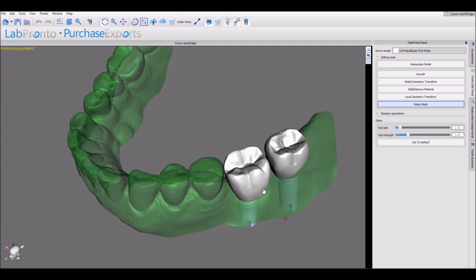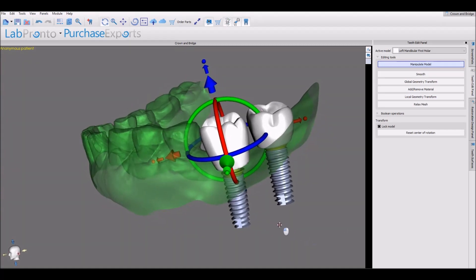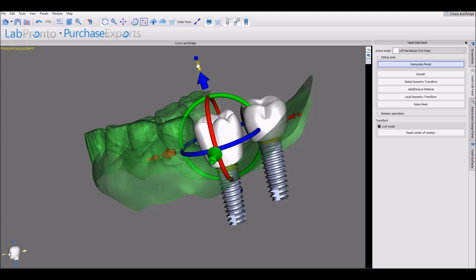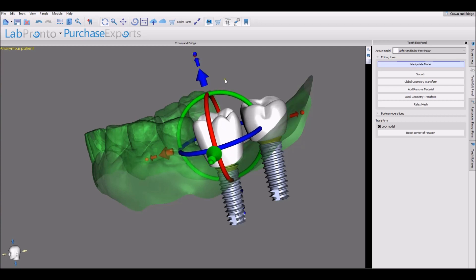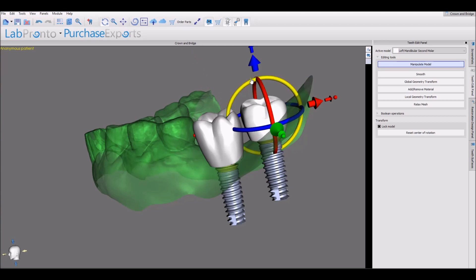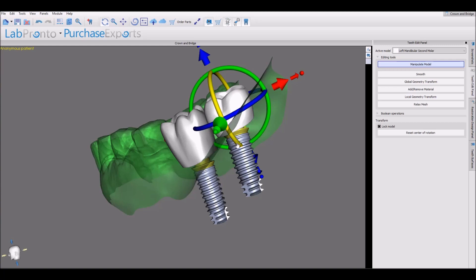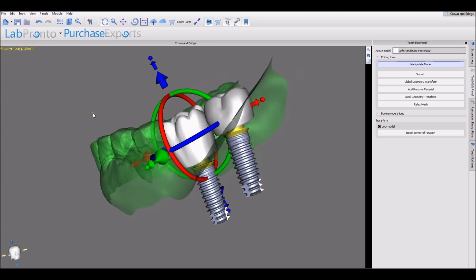Relax Mesh: hold down the Shift key and use your left mouse button. In general, we do want the tooth to interact and intersect with the model — it will help us out a bit later on, but it's not necessary and either way is fine.